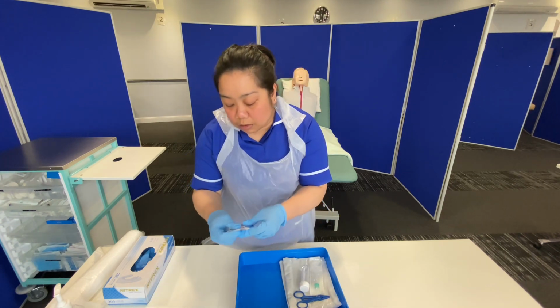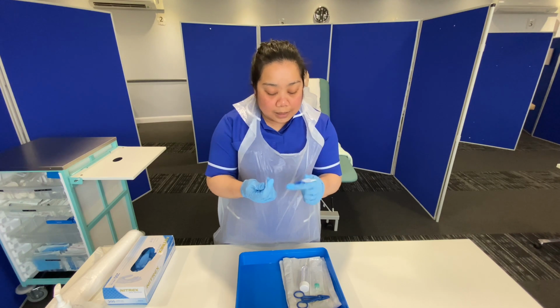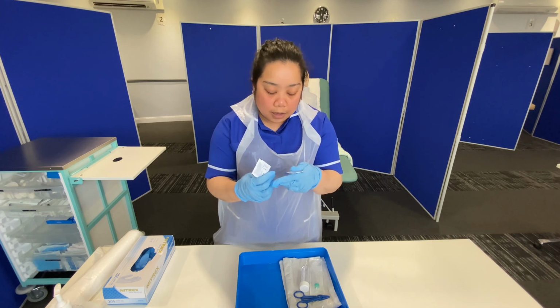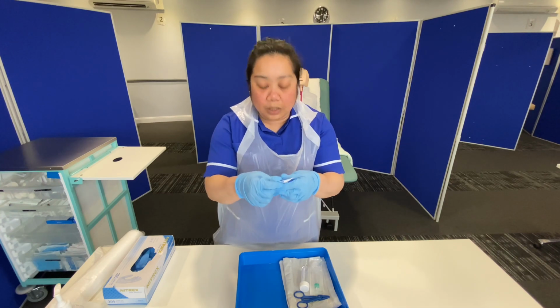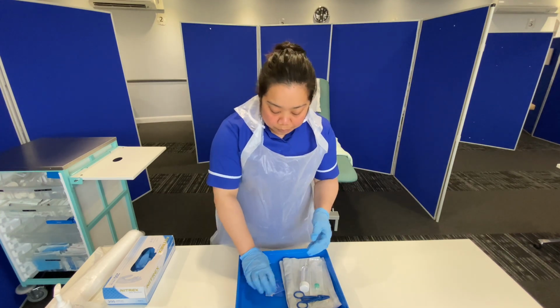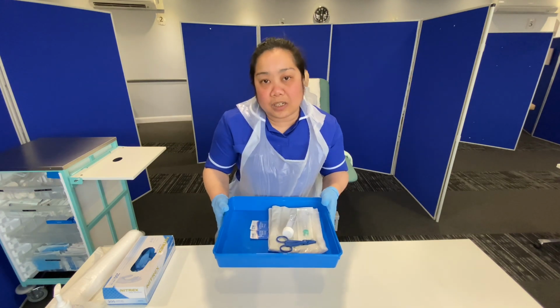And will need 2 Clinell wipes. Packaging is intact, clean, and dry. No discoloration, and they are both within date 2024. I'm happy to use them. So I've got all the equipment I need. I'm going to approach the patient at the bedside.